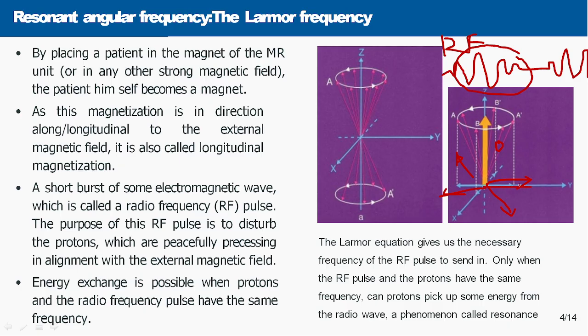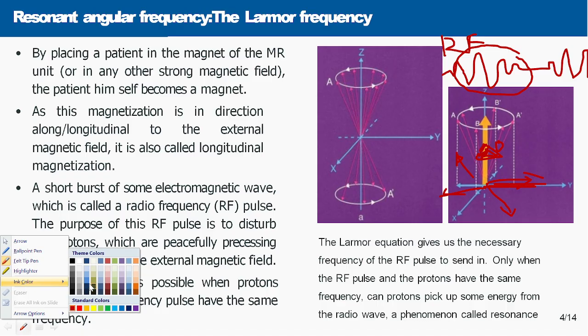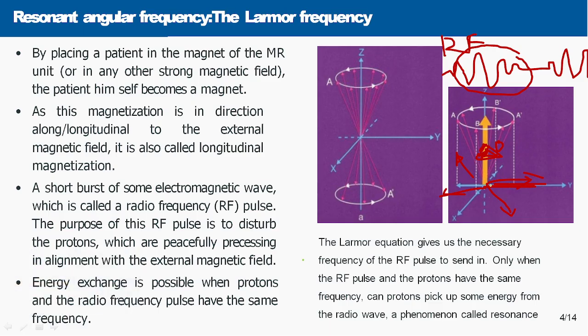The longitudinal component will be reduced in strength, and it will develop a magnetic field component in the transverse plane.